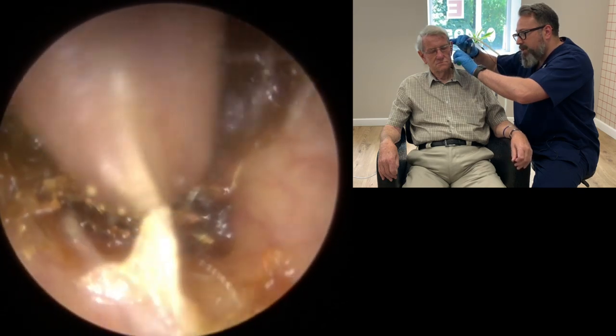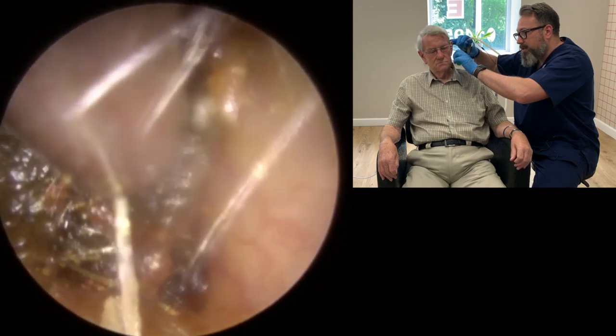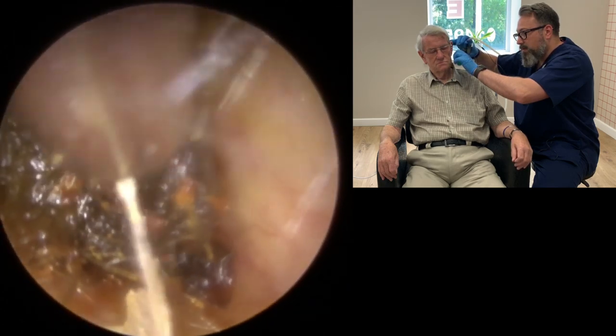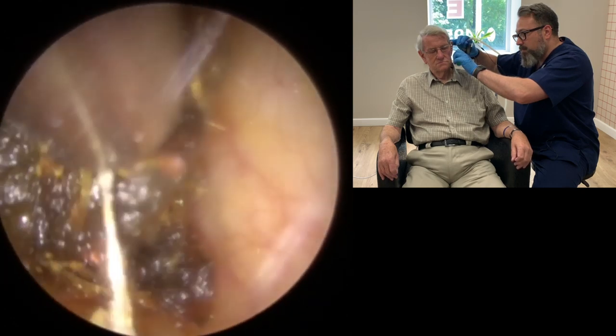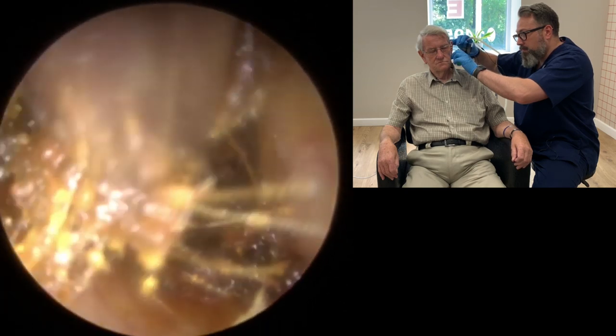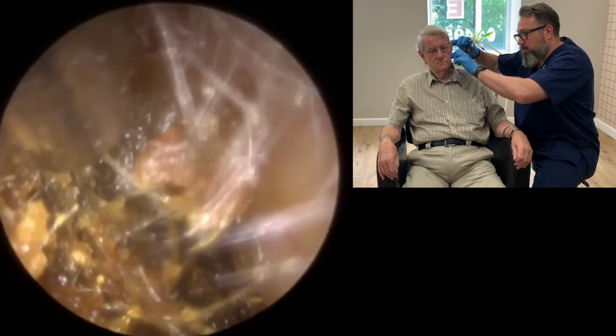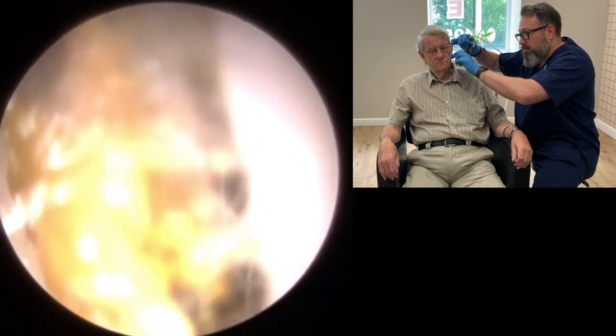Sometimes the wax can spread along the canal wall, so it's a good idea to try and take those bits away first, so we can get a good idea of the central core of wax that we have there. So you can see we've got a grip on a slightly harder piece now, just working off our right-hand canal wall. There we are, there's a little bit coming away from the left-hand side. You can see now we've broken it away. See how it forms a much, much larger section coming away? There we are. We're doing really well.